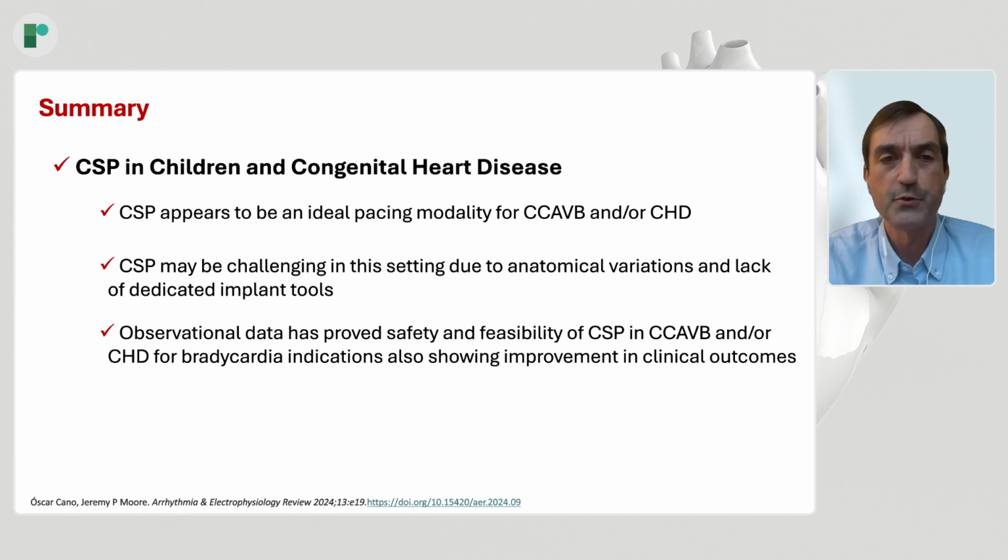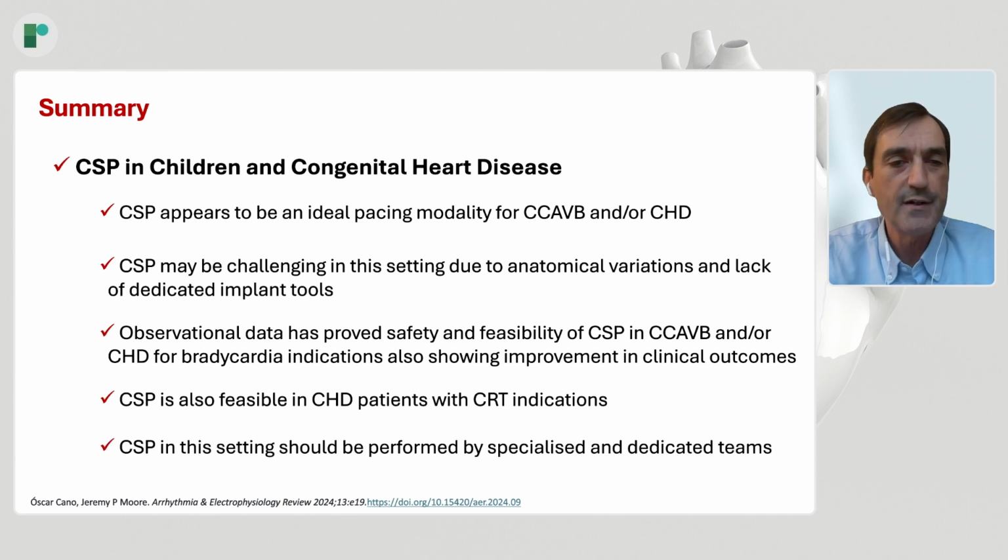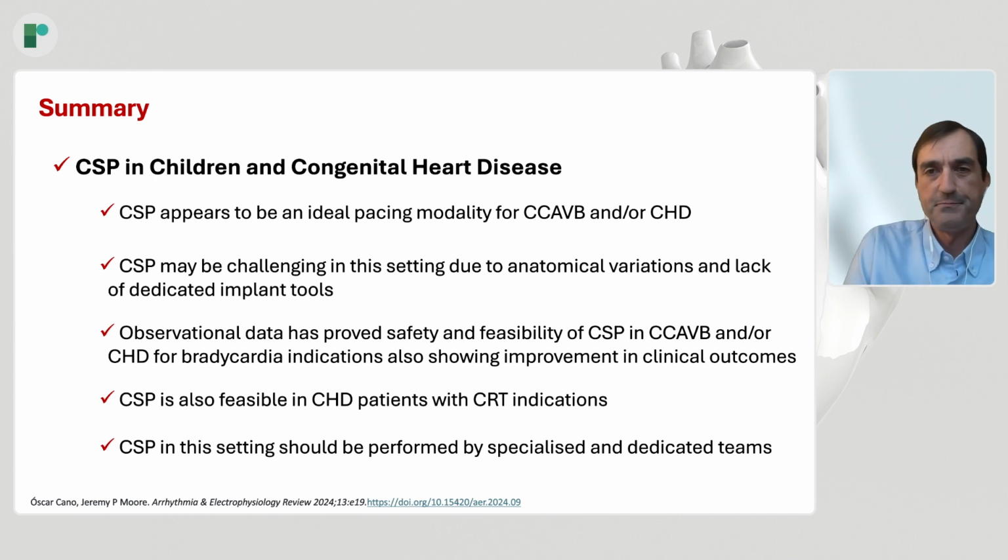Observational data has proved the safety and feasibility of CSP in this setting for bradycardia indications, with improvement in clinical and echocardiographic outcomes. CSP is also feasible for congenital heart disease patients with CRT indications. Finally, CSP in this setting should be performed by specialized and dedicated teams. Thank you very much for your attention.